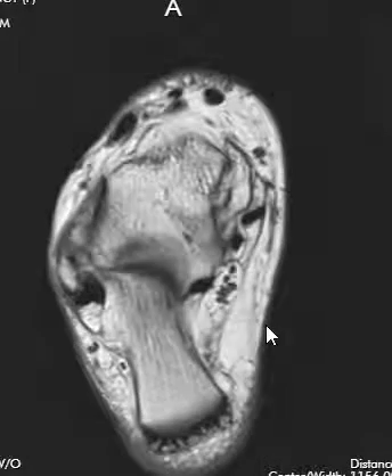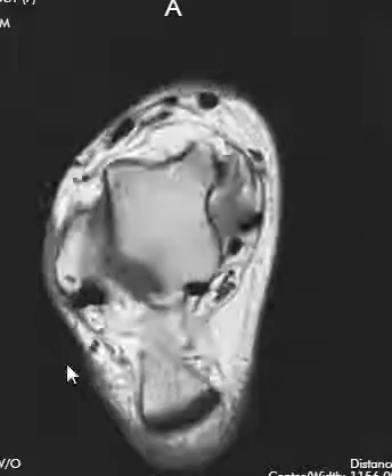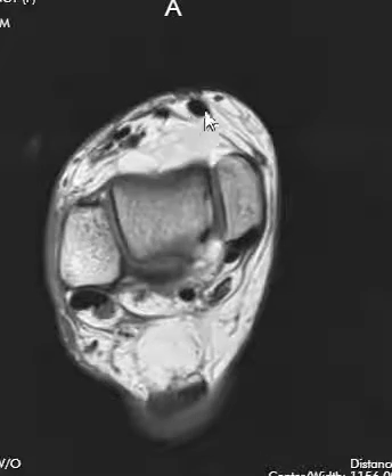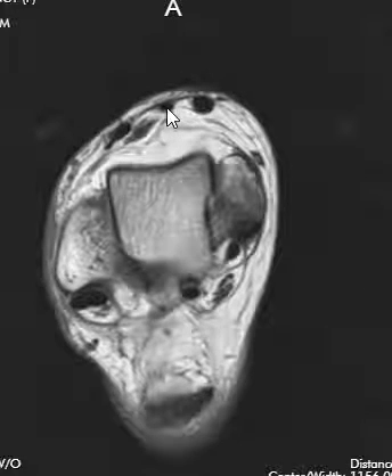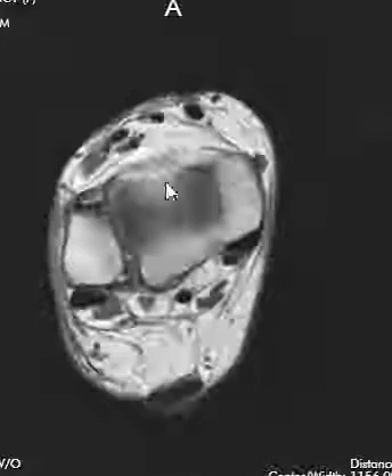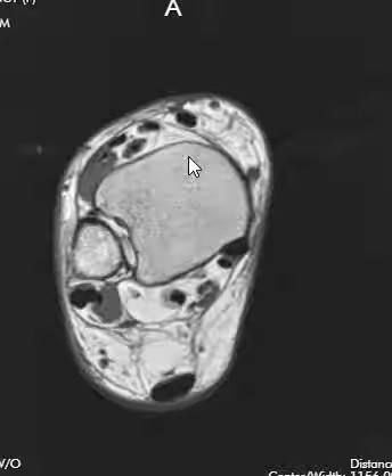Then we jump over to the front to finish things off. In the very front, we have the anterior tibial tendon, the extensor hallucis — which goes to the big toe and helps the toe lift up — and then the extensor digitorum here in the front. We look at all these tendons to see if they have tendinopathy, tearing, or fluid around them called tenosynovitis.